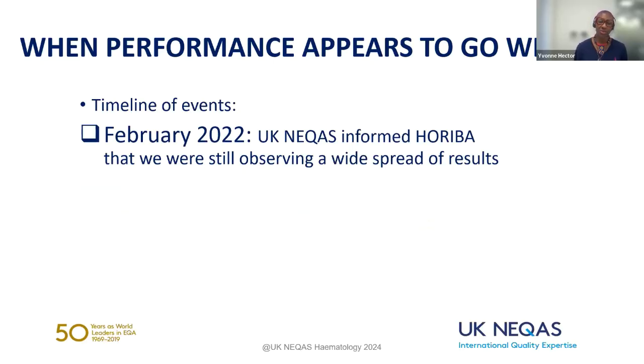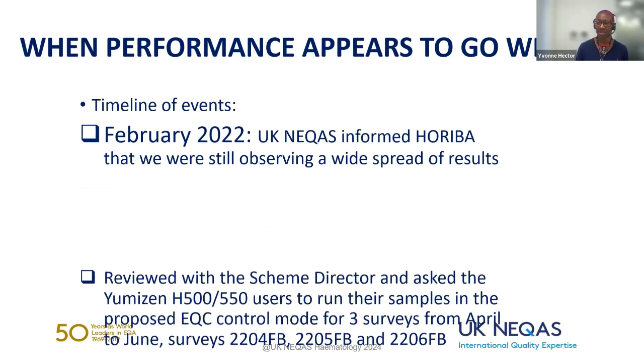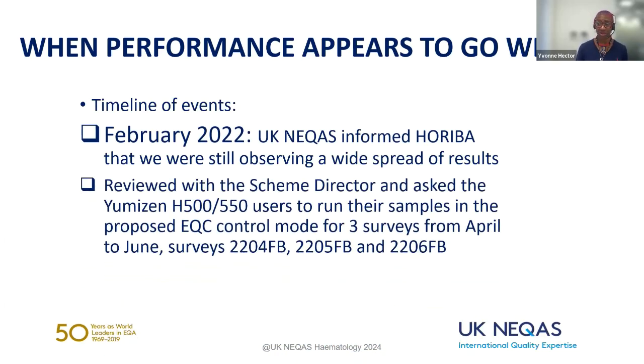So I reviewed this with the scheme director, and we agreed to ask the Yumizen 500 and 550 users to run their specimens in the proposed EQC mode for the next resurvey. That would have been from April to June in 2022, so the 2204 FB, 2205 FB, and 2206 FB surveys. I also planned to create a separate instruction sheet to facilitate this in conjunction with Horiba.